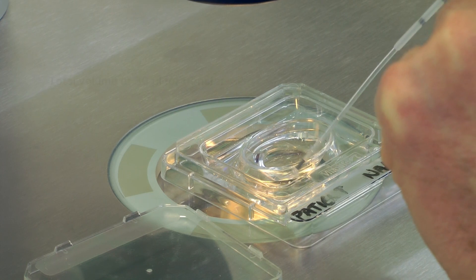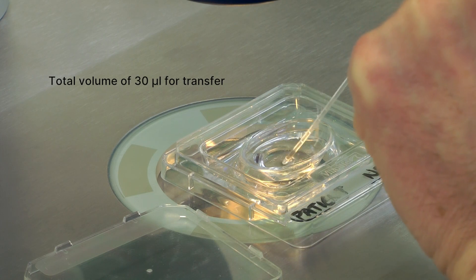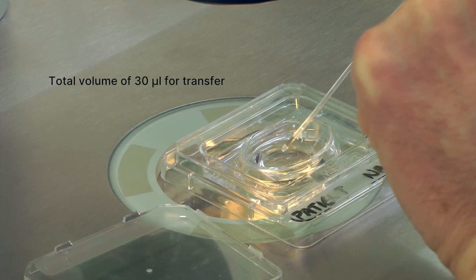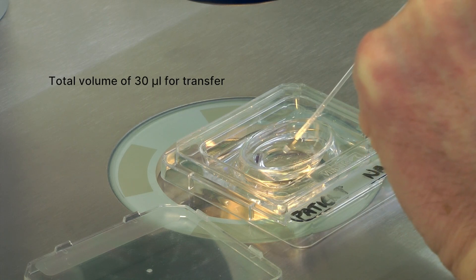Under microscopic control, gently load the embryo into the catheter in approximately 5 to 10 µL of Embryo Glue, followed by a small volume of air.